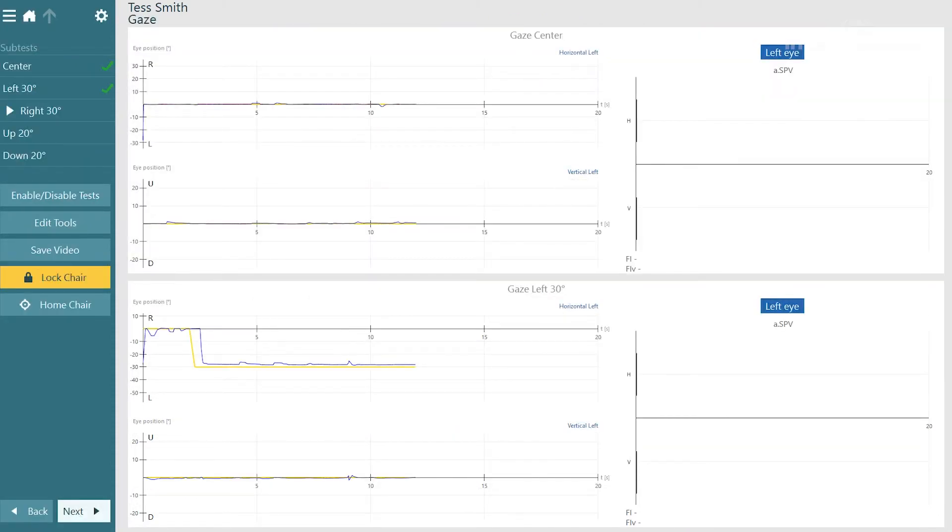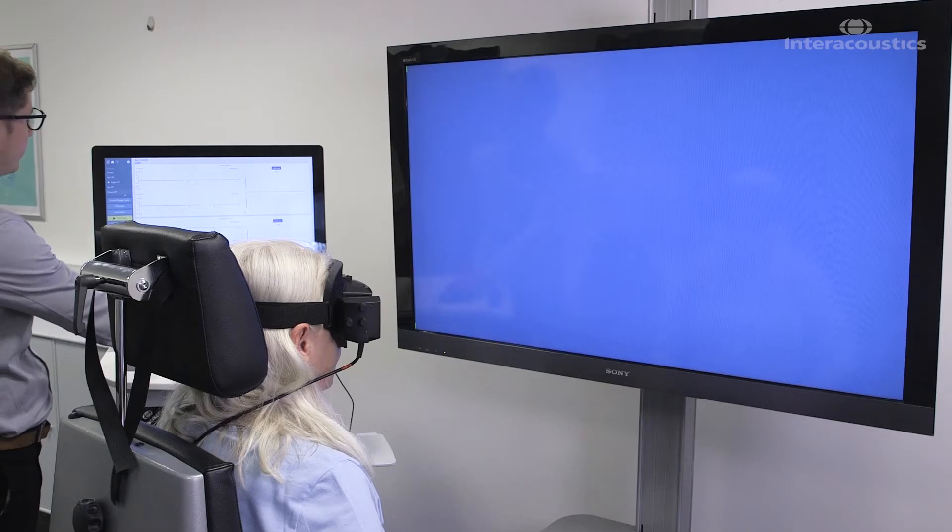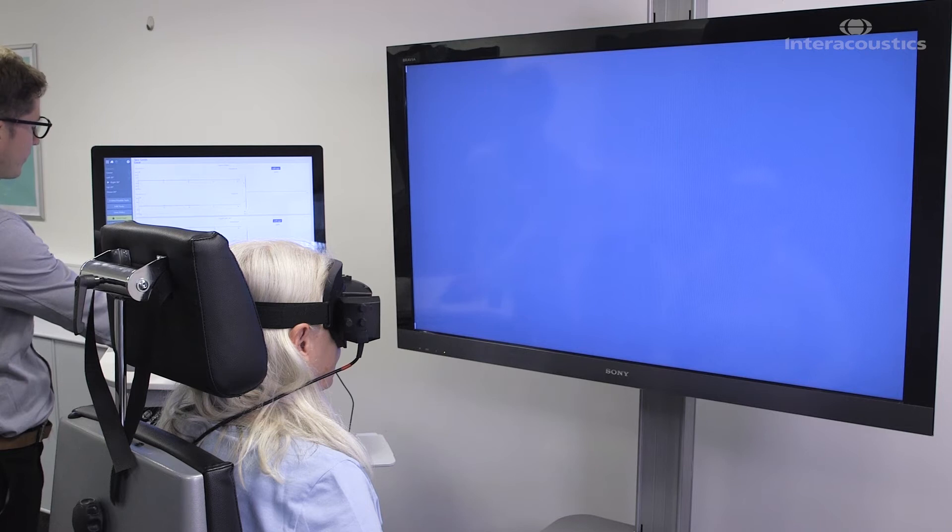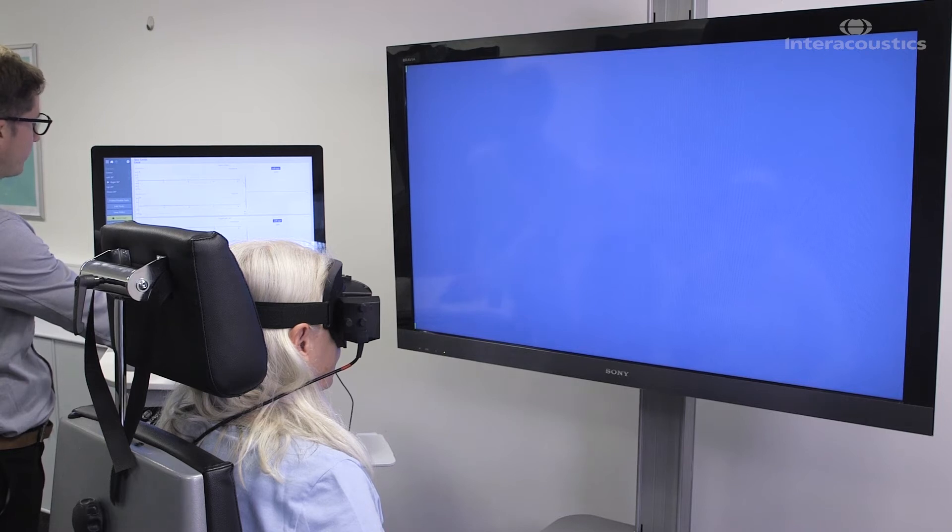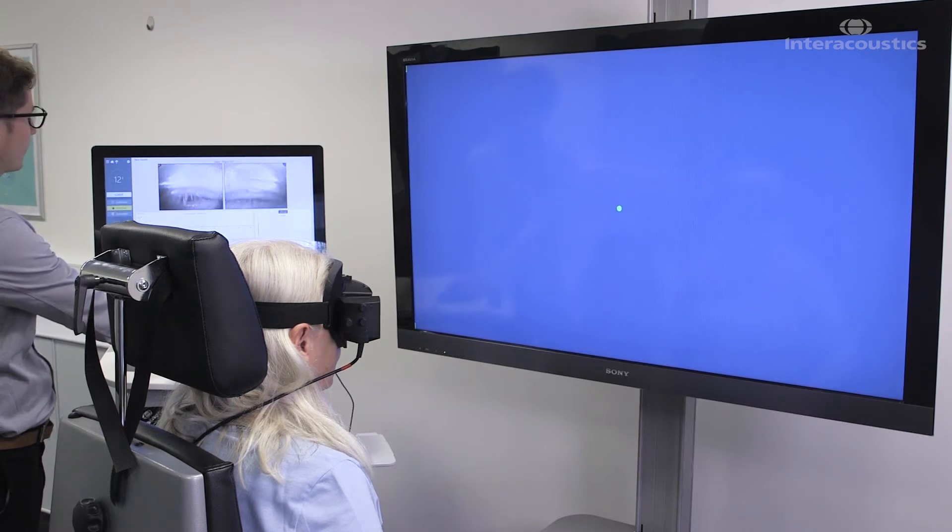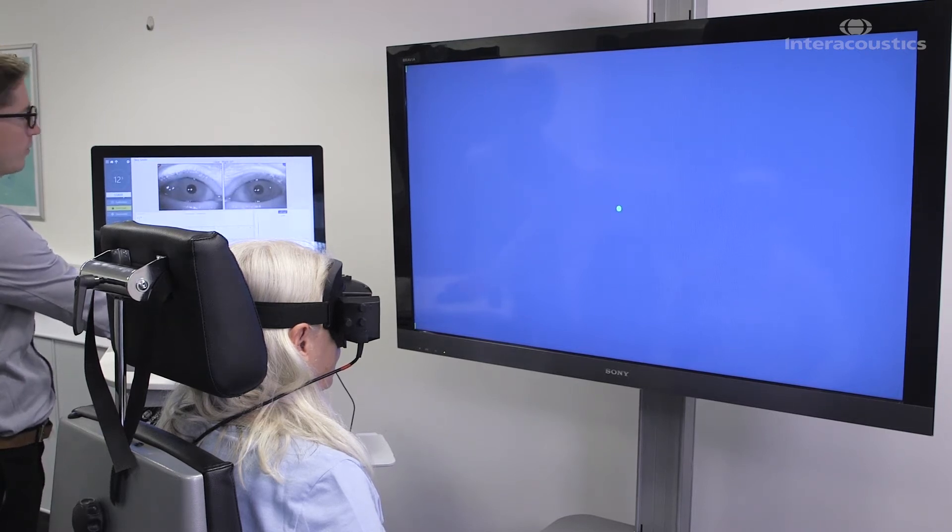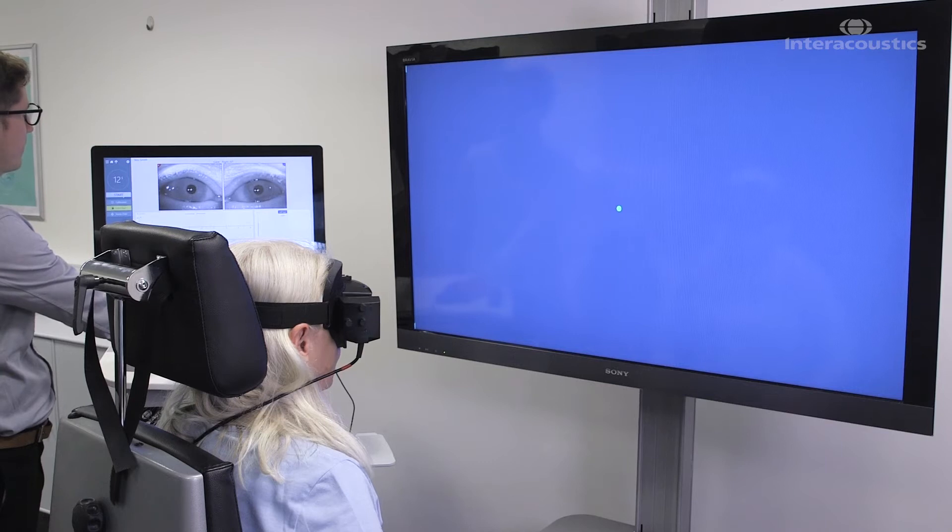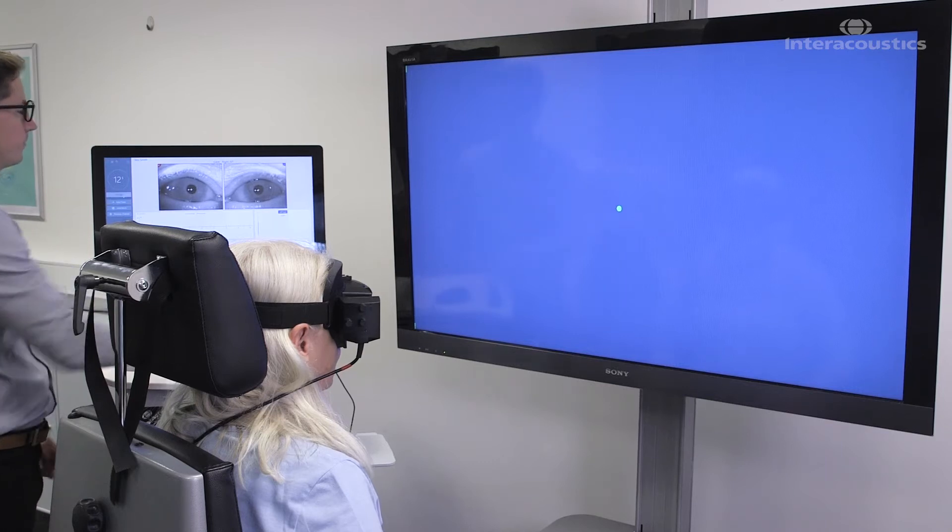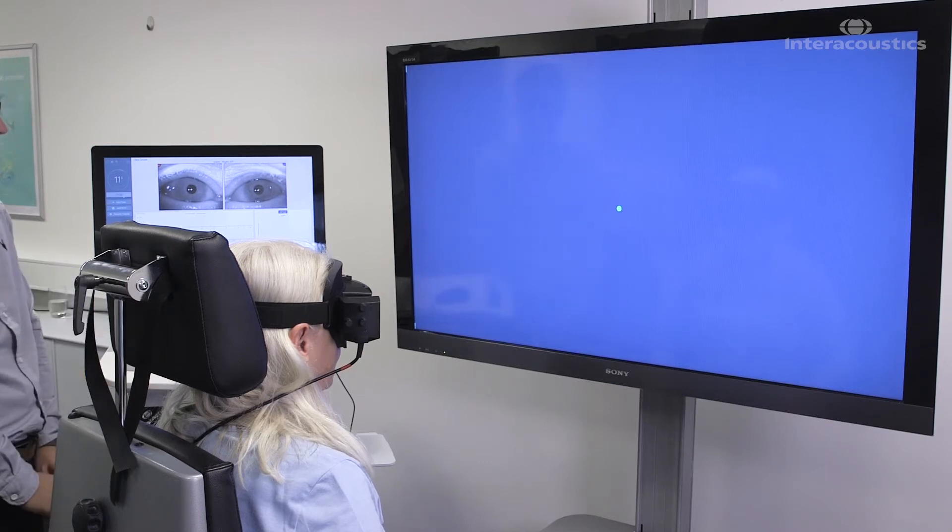Okay, we're going to move on to the next condition where the target's going to move to the right. So again if you can look at the center dot for me. Eyes open and here we go. Counting down from 12.